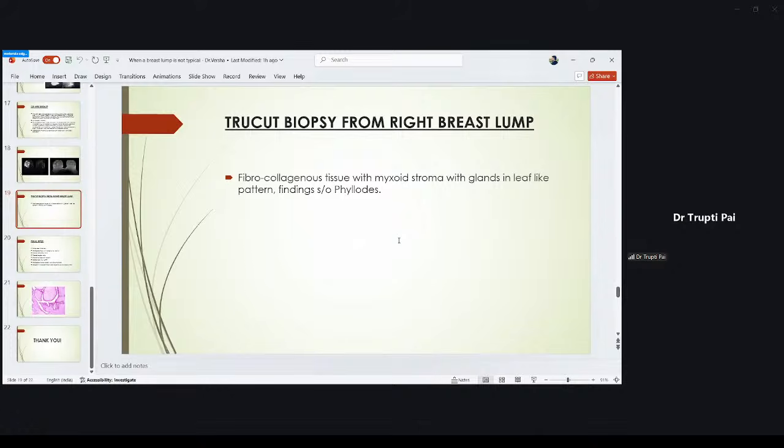If it is diffusely positive, it is a type of sarcomatoid carcinoma. Or if there is too much stroma, even if you see some dilated epithelial component, your first differential will be a sarcoma in a background of malignant phyllodes.